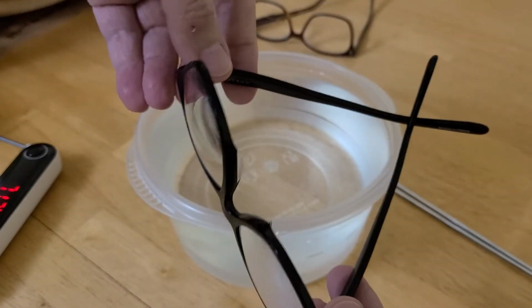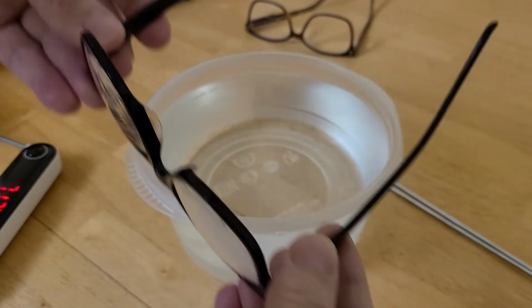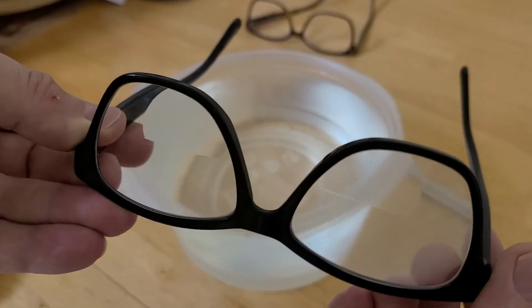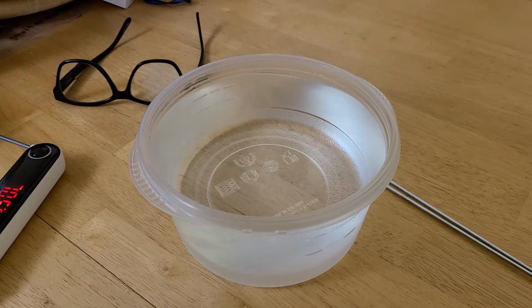So 130 degrees for acetate frames, soaked for a few minutes, allowed me to apply light pressure and bend the frames for a slightly looser fit.